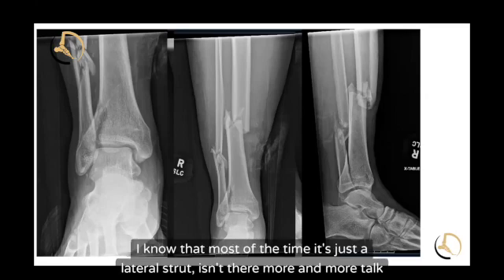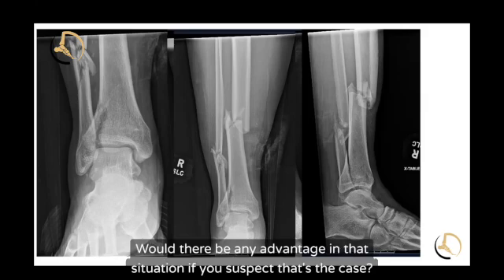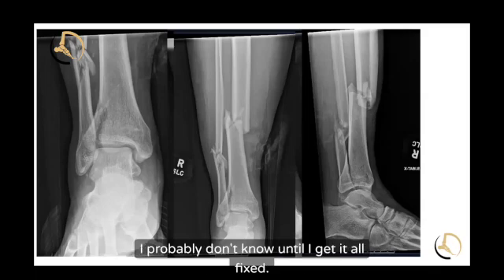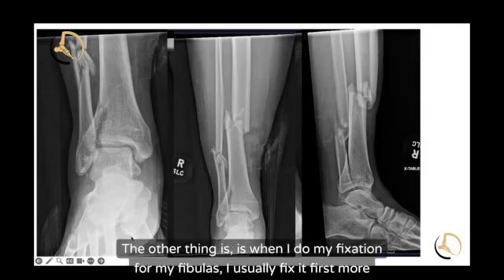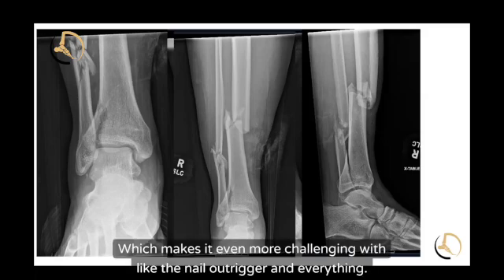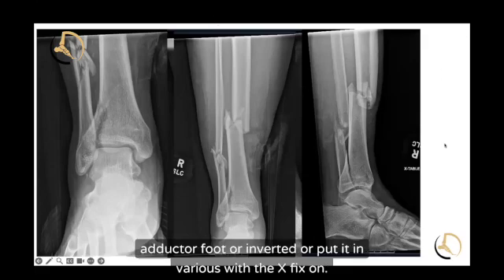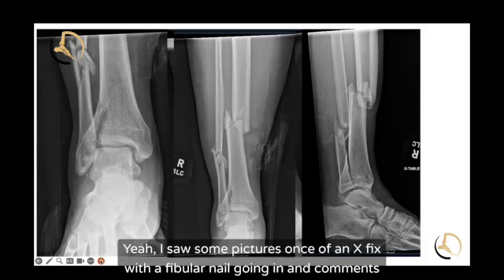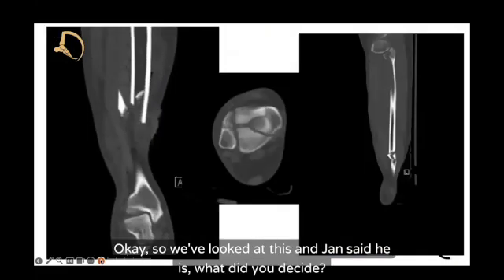What about syndesmosis involvement? There's more and more talk about some pilons having possible syndesmosis involvement. I probably won't know until it's all fixed, and then I'll just put a screw in around the Nancy nail or something. When I do fibula fixation, I usually fix it first with the external fixator still on, which makes it even more challenging with the nail outrigger. The Nancy nail or flexi nail is hard enough because you can't really adduct the foot or put it in varus with the X-fix on. I've seen pictures of an X-fix with a fibular nail going in — comments about how challenging that situation was.